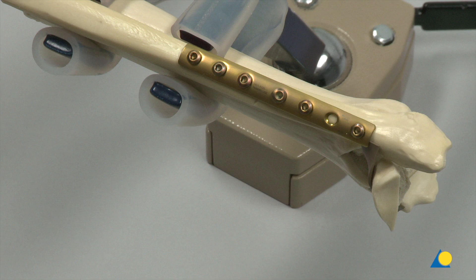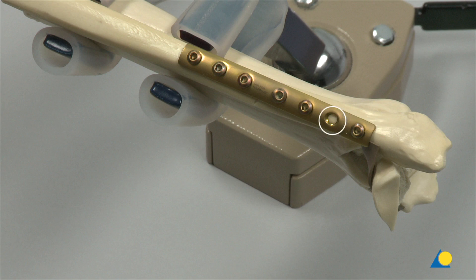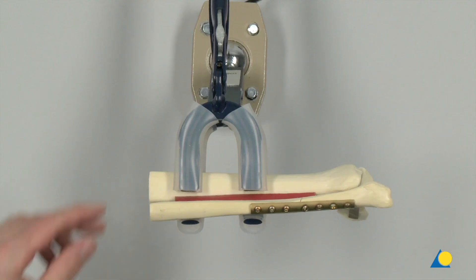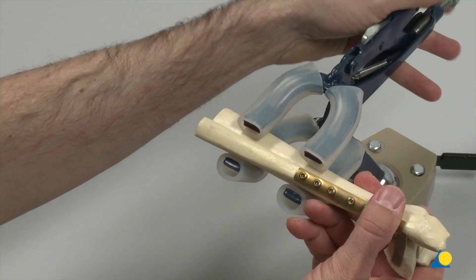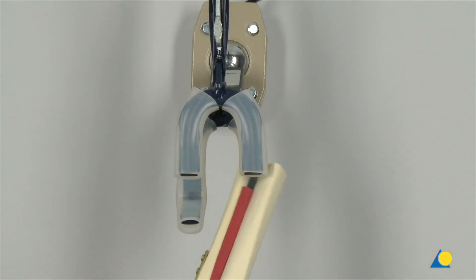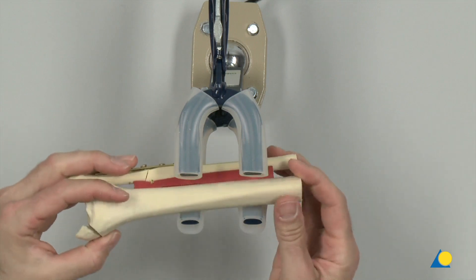All the remaining plate holes are filled, except for the 2nd distal hole, which will be used later for the position screw. To facilitate access to the medial maleolus, the bone model is released from the clamp and rotated 180 degrees.